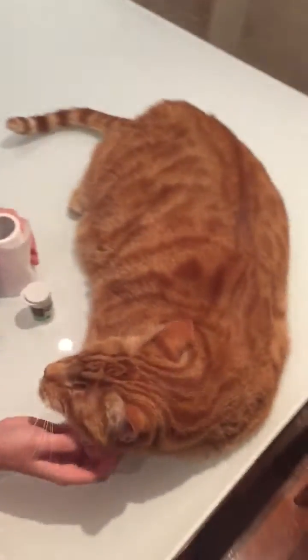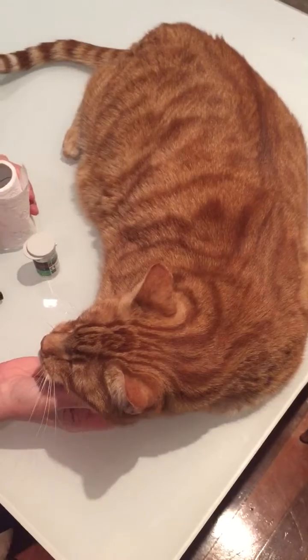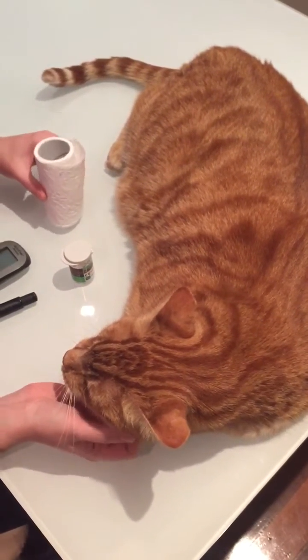Hi, this is Jasper, and today we're going to show you how to take a sample for his blood glucose testing.